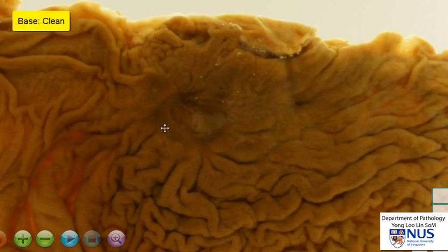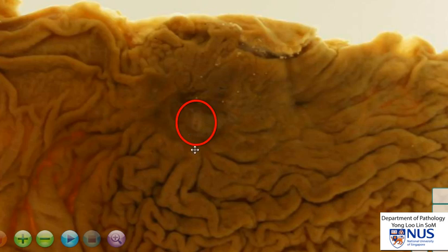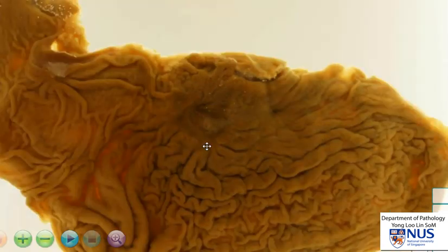The base appears relatively clean and if you look carefully, you can actually see a blood vessel. This is a cross-section of a blood vessel located in the base, which will give you a good clue as to how this patient could have presented clinically — possibly because of erosion into the vessel, there could have been quite severe upper GI bleeding.